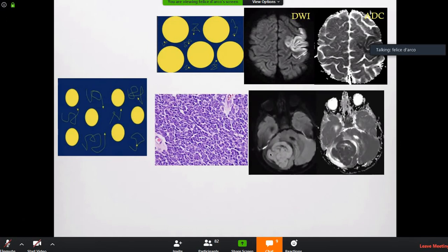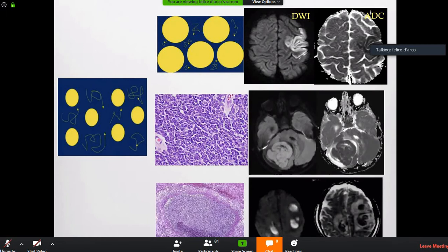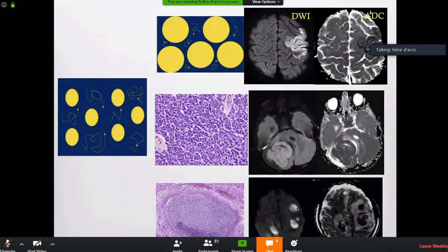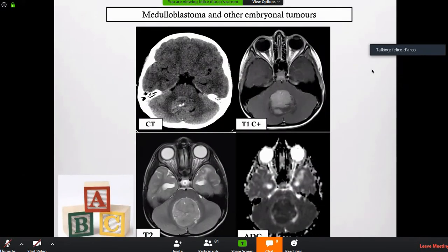When you see a tumor with diffusion restriction in a child, think embryonal tumor. The tumor intensity on DWI is brighter than cortex, and cortex itself is packed tissue. DWI restriction is also seen in pyogenic abscess — the core of the abscess is full of debris with no water, showing striking restriction. This allows you to distinguish an abscess from a necrotic tumor center.